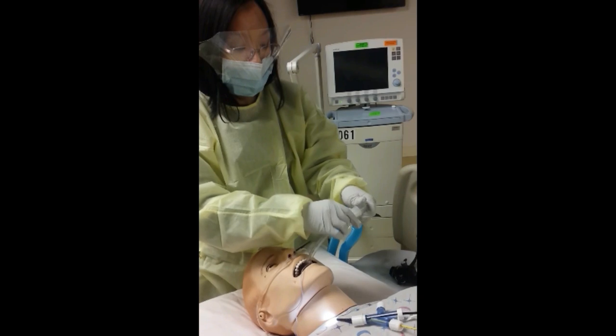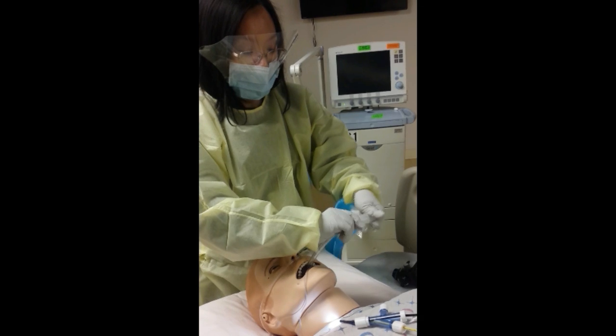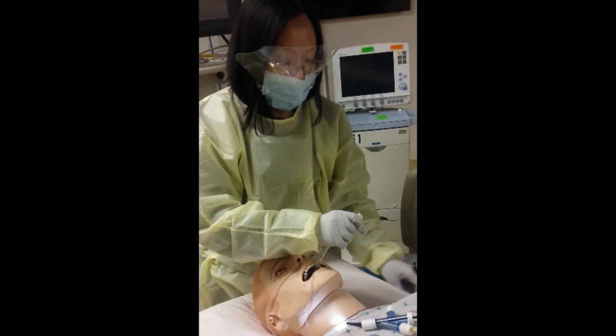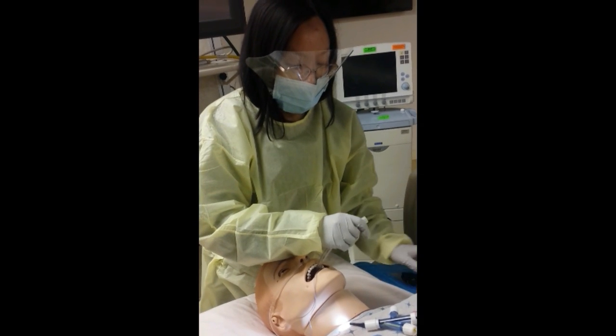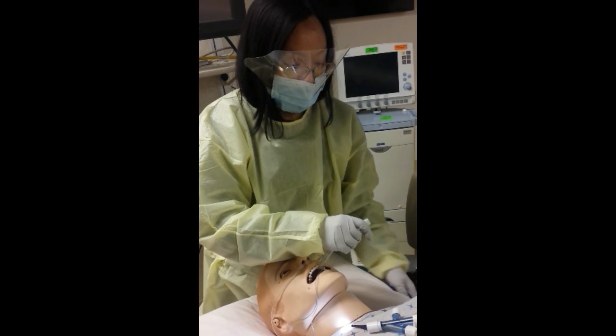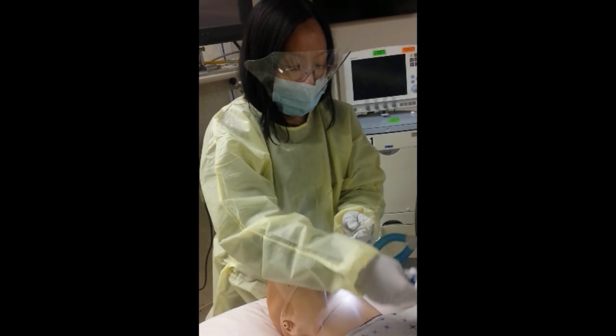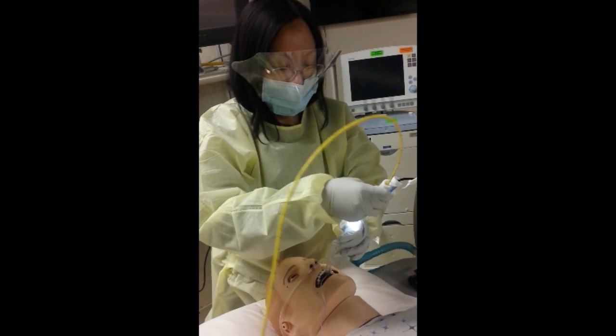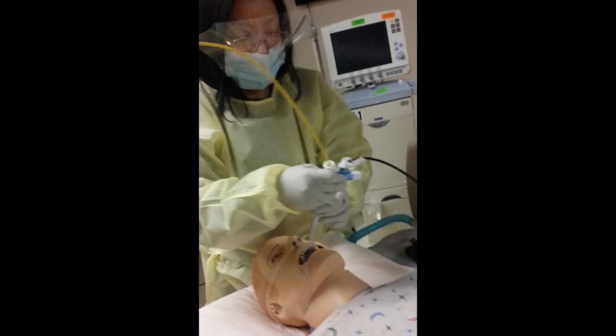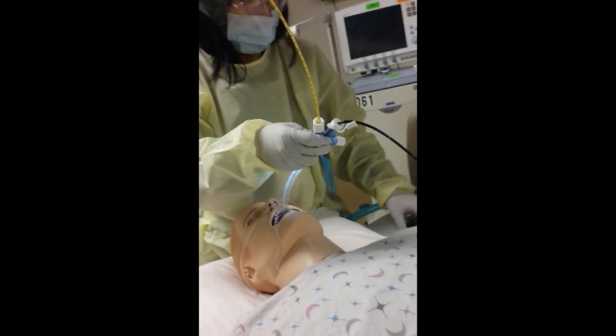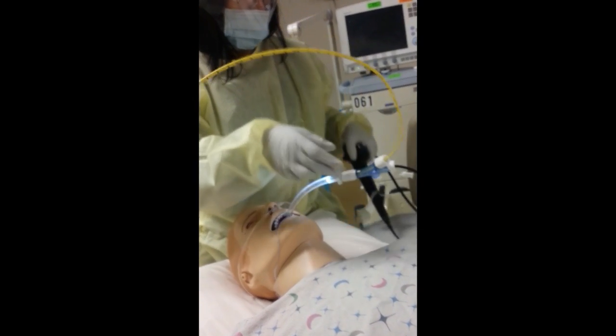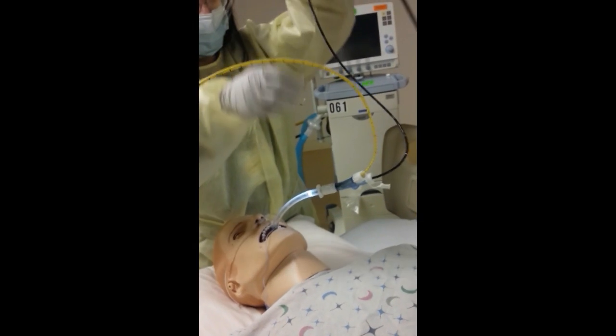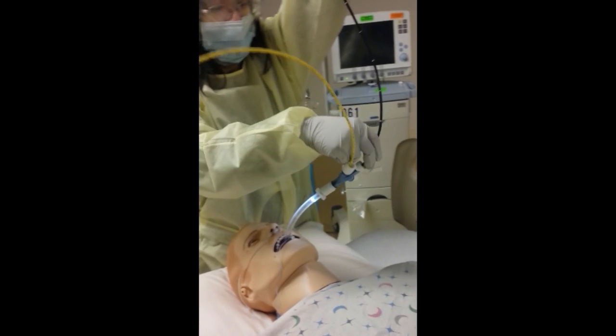Then, disconnect the ventilator and attach the adapter with the scope and blocker to the endotracheal tube. Reattach the ventilator to the remaining port of the adapter, which is not shown in the demonstration.